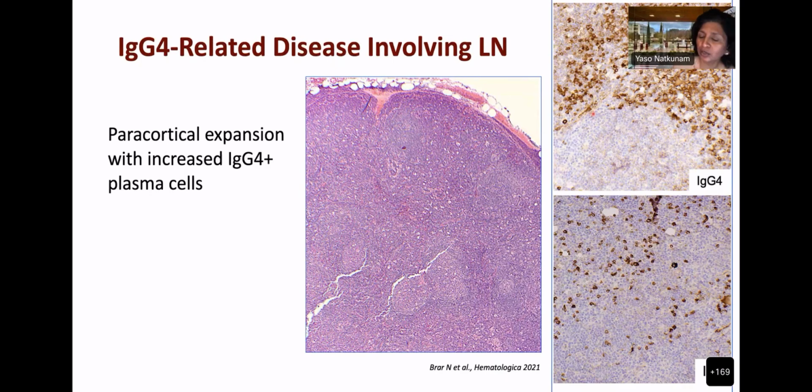But if you are close to 40% or way less than 40%, you should look at different areas, because sometimes you see that accentuation only in a couple of follicles or focal areas, and you don't see it everywhere. So you can't use cutoffs like that blindly, and of course, when you narrow the area that you're examining, you can get to 40% more easily.